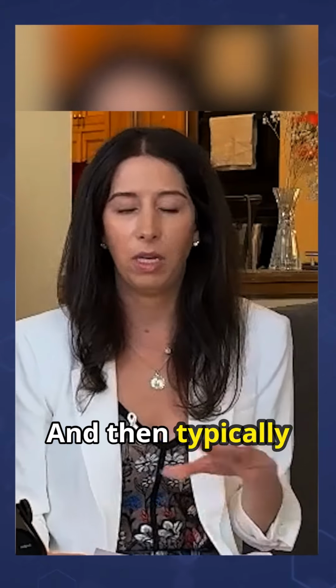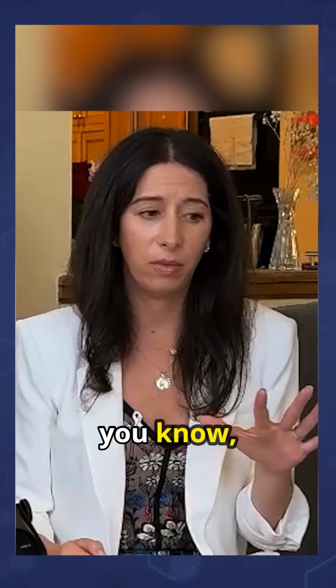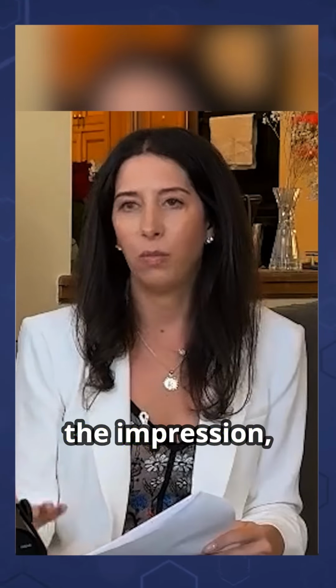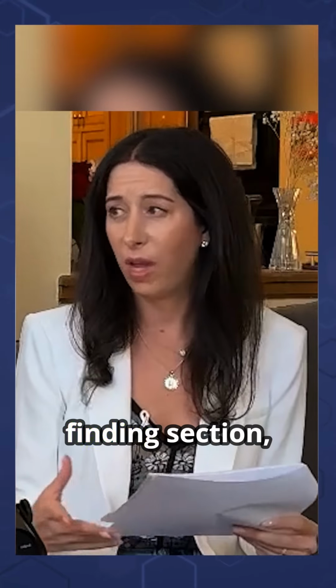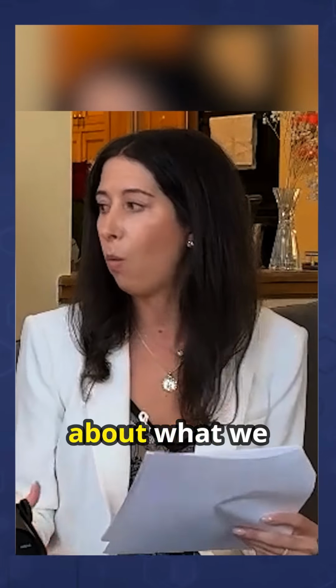And then typically the next section would be the findings section. This is where the radiologist goes through everything that they see. And then there's the impression. And this is really the takeaway. So based on what we're seeing, everything we described in the findings section, this is where we form an opinion about what we think is going on. And we give recommendations about next steps.